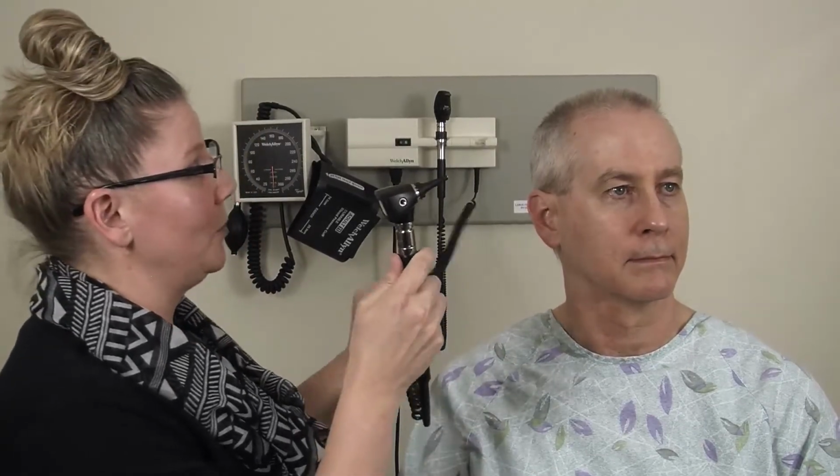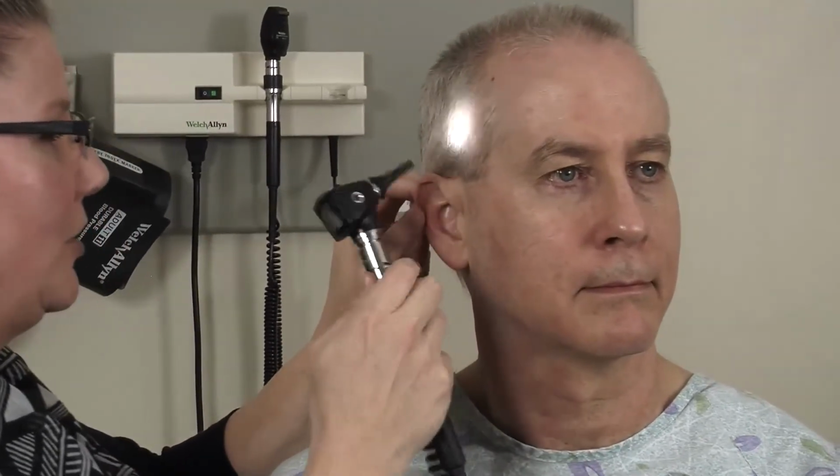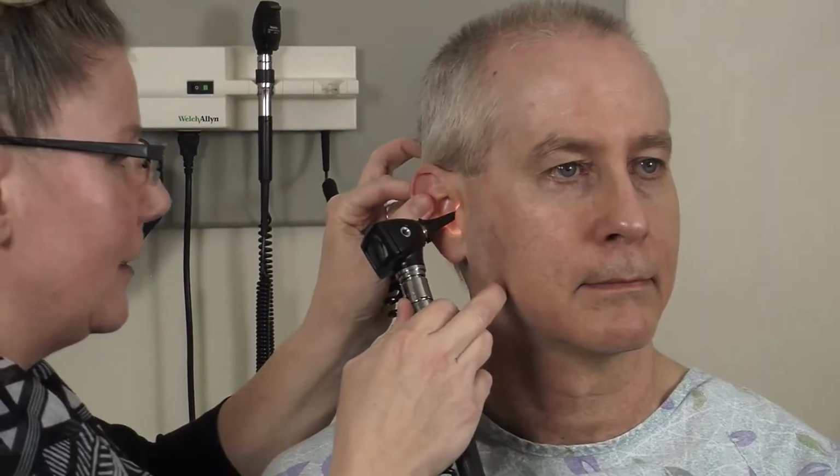Another thing to make note of is to brace. For example, especially if you have a child who maybe doesn't want to sit as still as Steve does for ear exams, you want to learn how to brace your otoscope so it moves when the patient moves. For example, you can brace by using your hands this way.